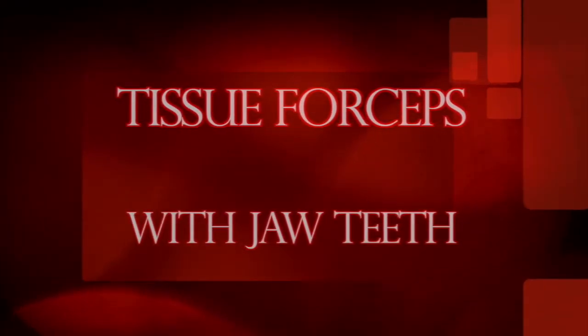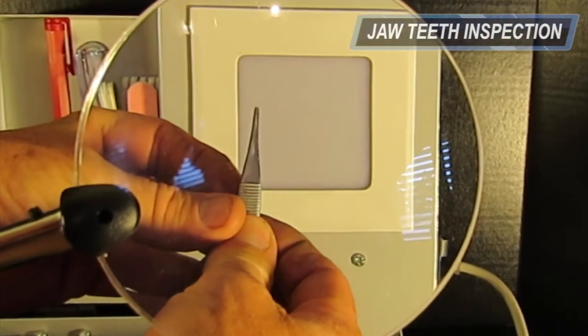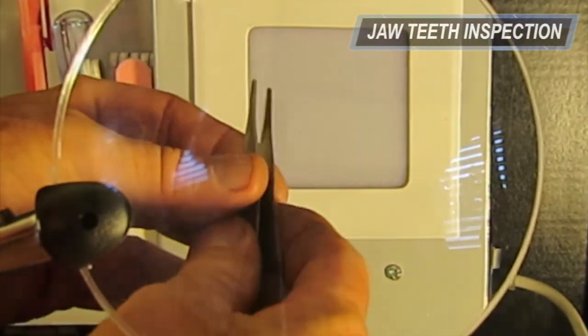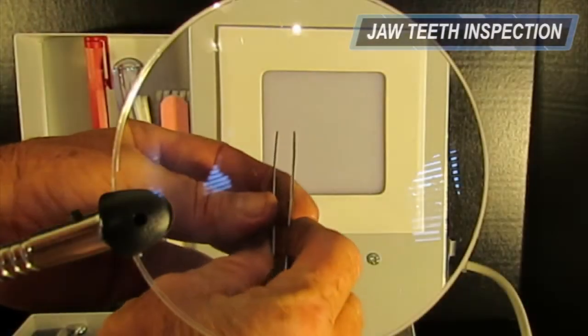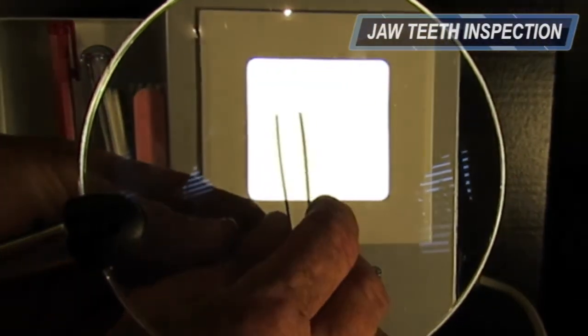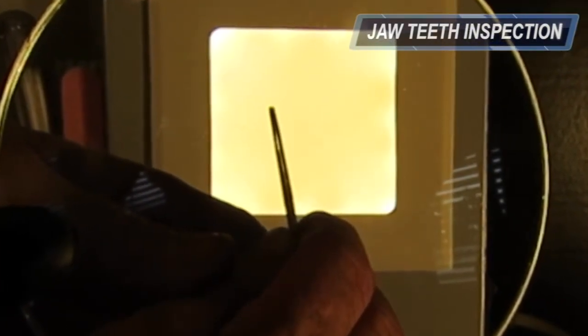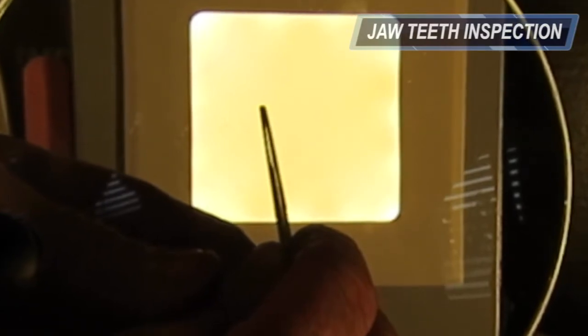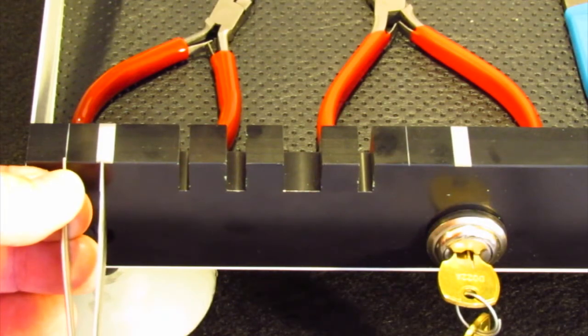To inspect tissue forceps with jaw teeth, first inspect the jaw teeth for distortion or burrs. Next, completely close the instrument while viewing the flat side. Inspect the tips closely to ensure there is no overlapping. Then position the instrument in front of the backlight and apply the same inspection process used on the jaws of ring-handled forceps. The forceps should touch at the tip and gradually close to the base with no visible gaps or distortion.